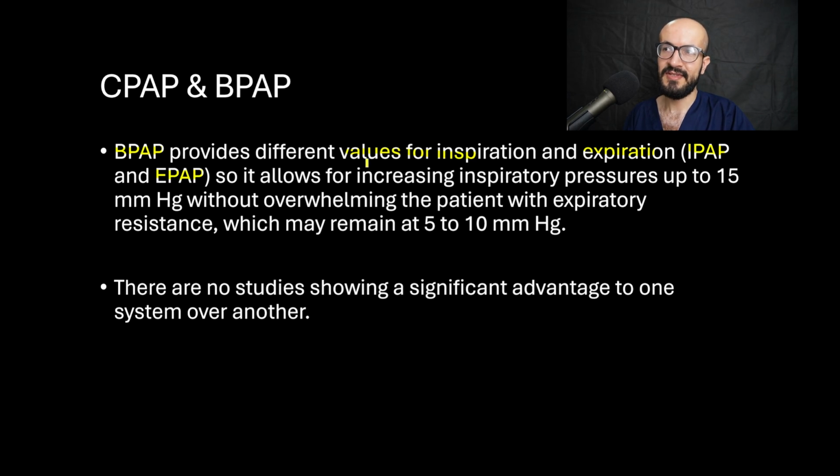It allows increasing the inspiratory pressures up to 15 millimeters mercury without overwhelming the patient with expiratory resistance, so you can increase the inspiratory pressures without increasing the expiratory pressures. This makes it easy for the patient to exhale air.